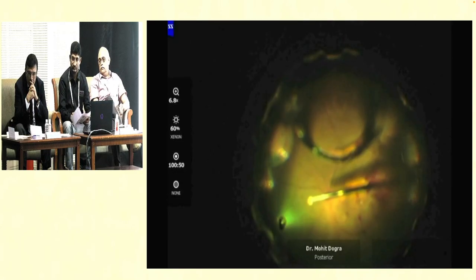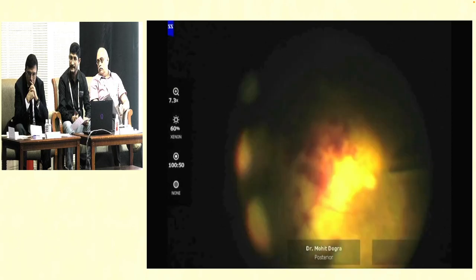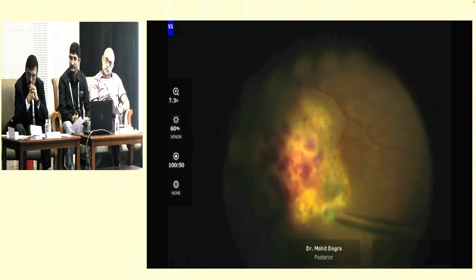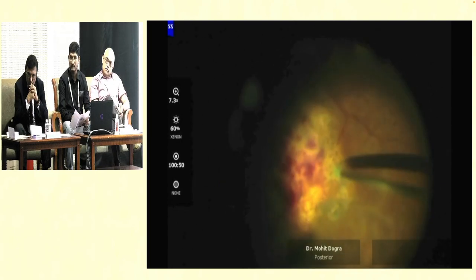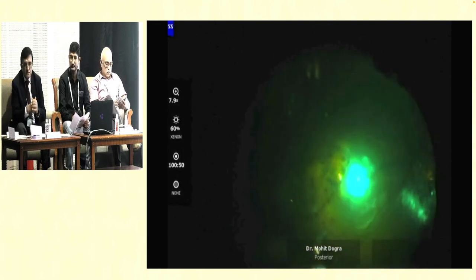Ports are sutured. A 36-year-old female is undertaken for diagnostic vitrectomy. The vitreous biopsy is taken as per steps previously highlighted. A retinotomy is made at temporal edge of large subretinal lesion using 25 gauge soft tip. Minimal invasive subretinal biopsy is taken. The tumor cells are displaced using this 25 gauge soft tip towards the retinotomy site. These repeated movements help in debulking of the tumor cells and their aspiration into the soft tip. Fluid air exchange followed by laser around the retinotomy is done.